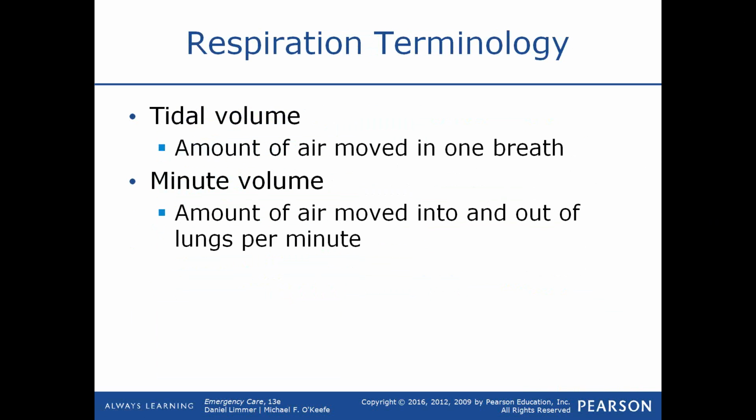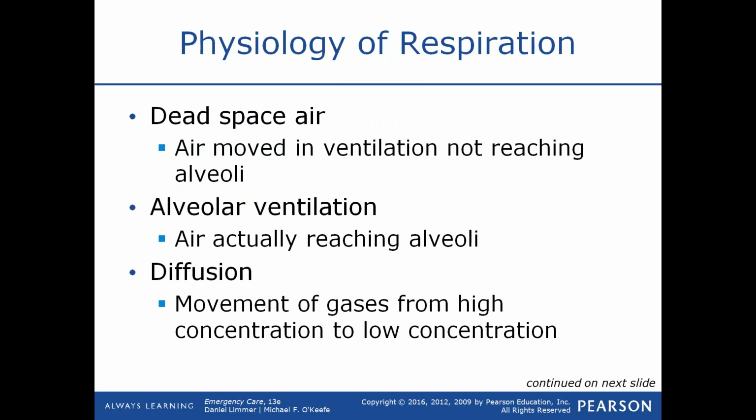And what I'd like you to take home from this is that if I'm ventilating a patient and I get the chest to rise once in a while because I don't get a good seal with my mask, I'm not providing enough minute volume. It's not enough to make the chest rise once in a while. We have to make the chest rise each and every time we ventilate them in order to move enough air in 1 minute to keep them alive.